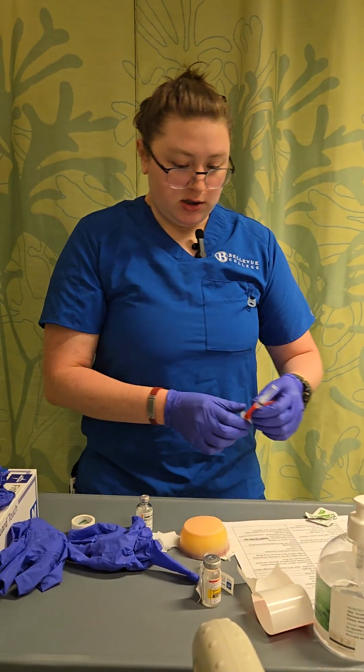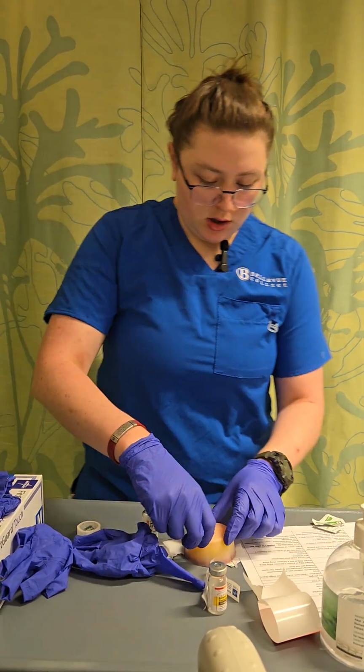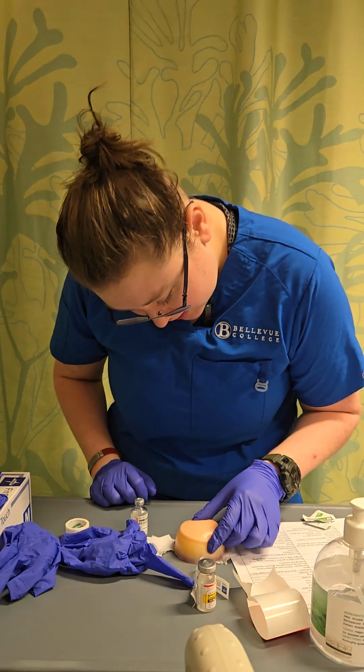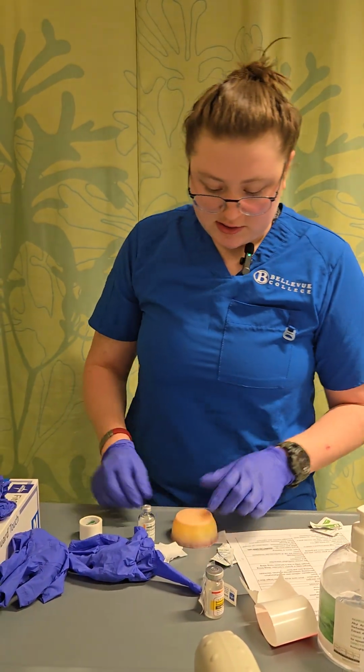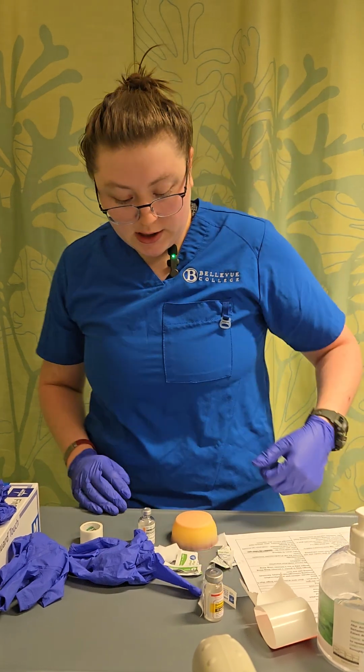And this is immediately going in the sharps. Okay. Rub. Make sure that this is not bleeding. This is good. If I need to, I could apply a Band-Aid. Doesn't look like the patient needs to at this time, which is great.